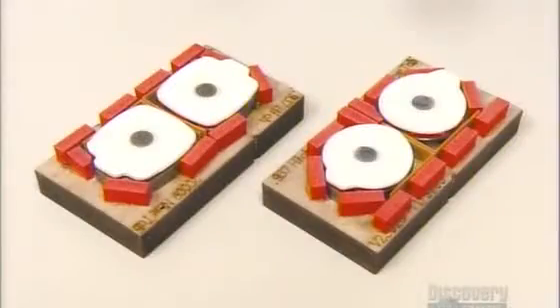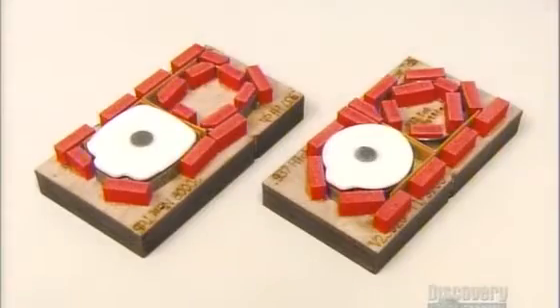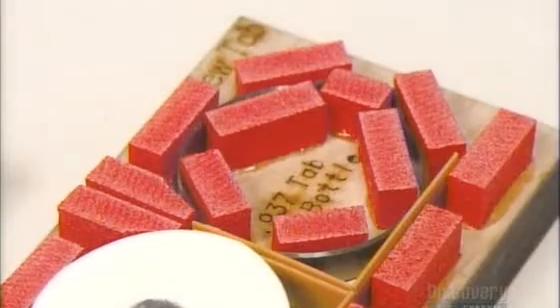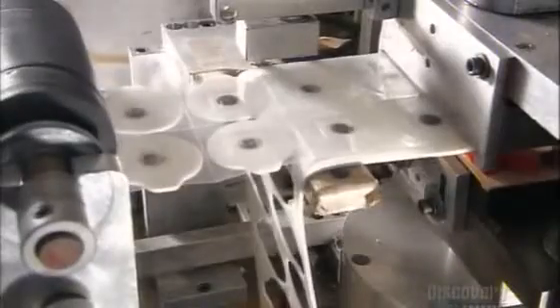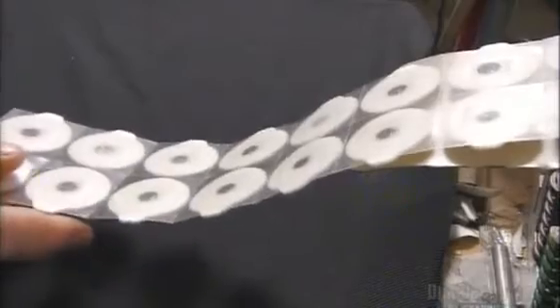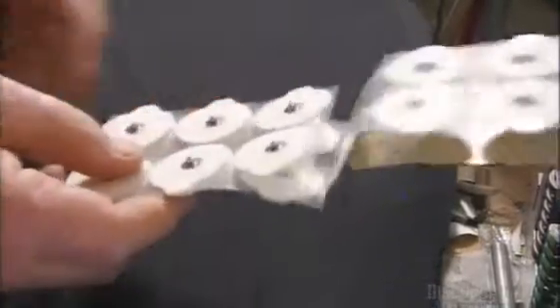That's protective padding you see around the cutters. It protects the blades from the adhesive on the foam as they punch out electrode shapes. Blades now lightly perforate the plastic liner around the electrodes, while below, equipment pulls away the scrap. The perforations will allow the electrodes to be torn into individual units later, and it also makes it easier to fold up for packaging.